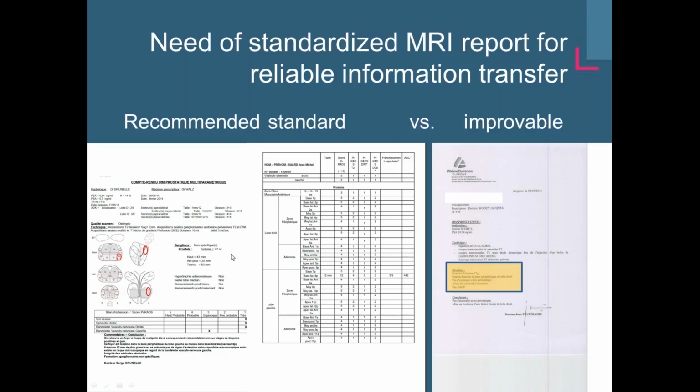And with such a report you can work, and ideally you'd also get some representative pictures of the prostate where you can then look at the MR pictures itself in order to familiarize with the location of the lesion you might go for a target. But this is the cornerstone.